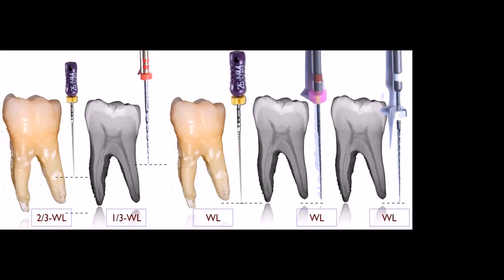Then, when the 8 is super loose in the root canal, I change and start to negotiate the root canal using the 10K file, with watch winding movements. When the 10K file reaches the apical terminus, I start with the push-pull movements.